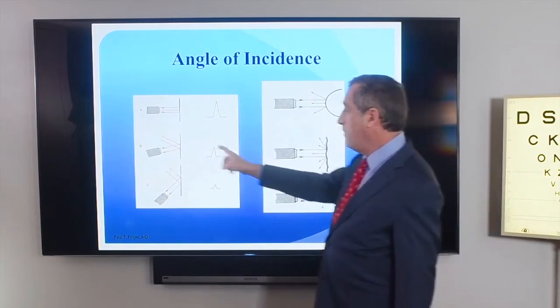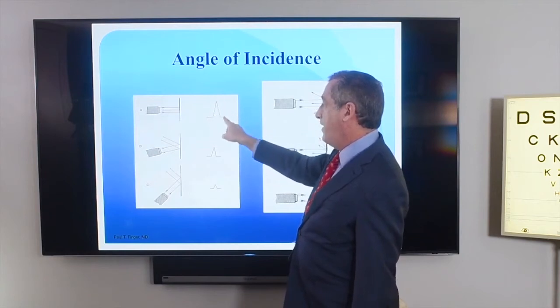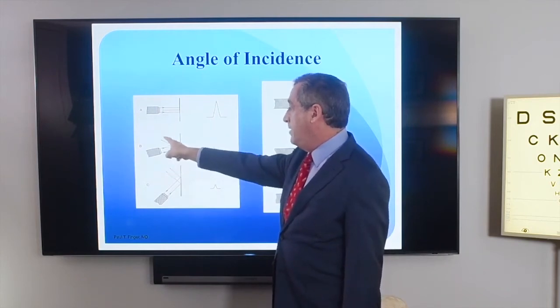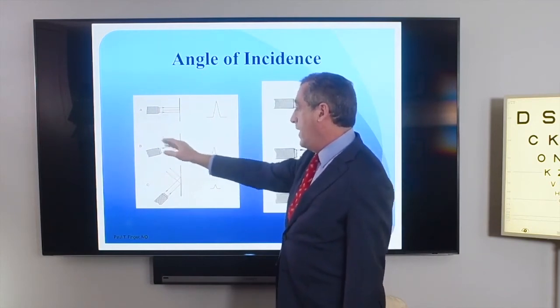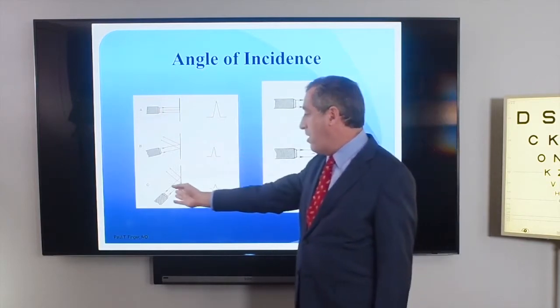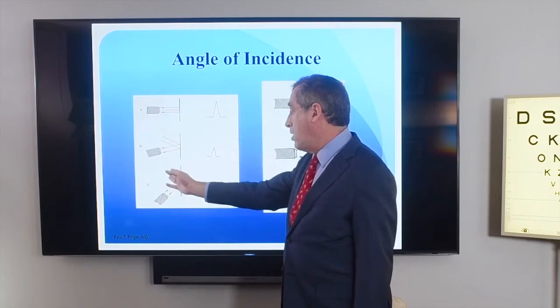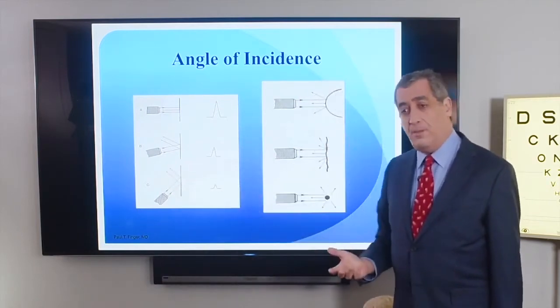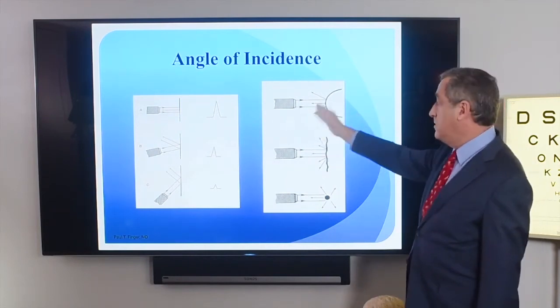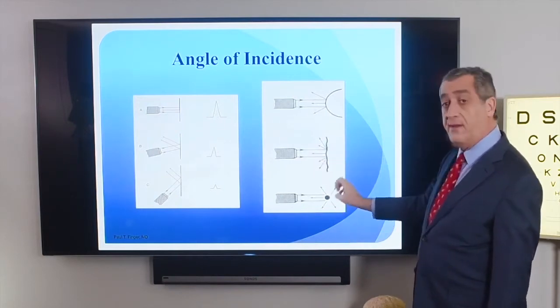Another, and the last major point on physics I'd like to make, is the angle of incidence. If you have your ultrasound probe directly against an object, it'll reflect a lot of sound, and you'll have a very bright, crisp image. If you're not directly at the object, some of the sound will be reflected away, and you'll have less information coming back to your probe to create the image. And the farther away you are from the tumor or object, more sound is reflected, and you have a poor image. It's also true that if what you're imaging is round, some of the sound will be reflected away, or if it's irregular, or in fact, if it's small and very highly reflective.